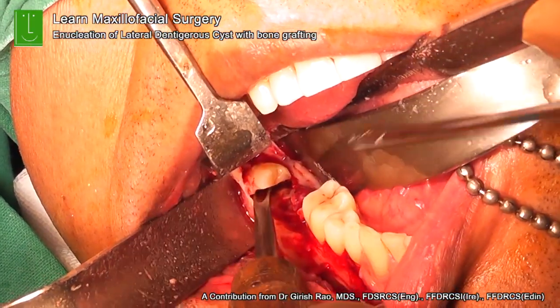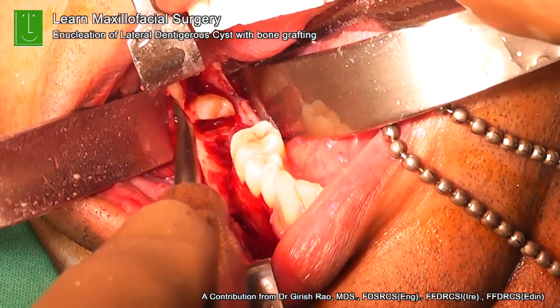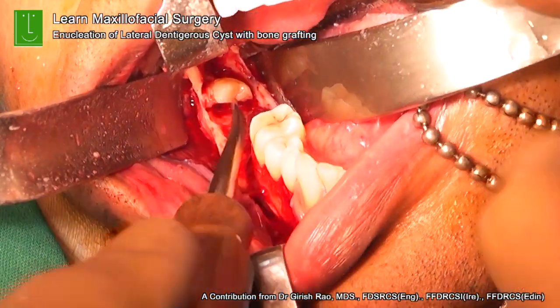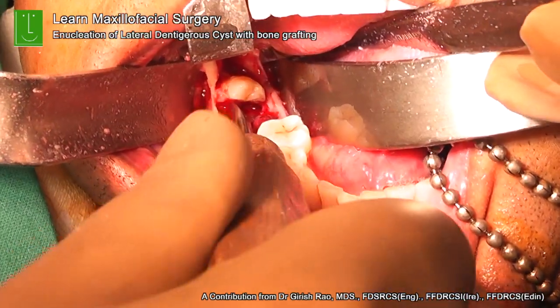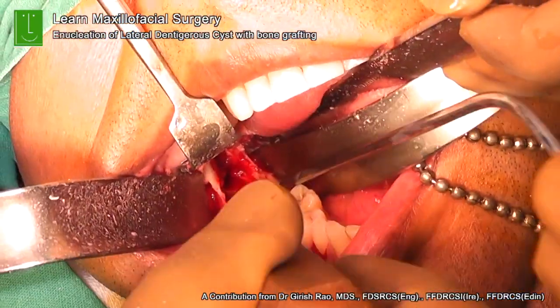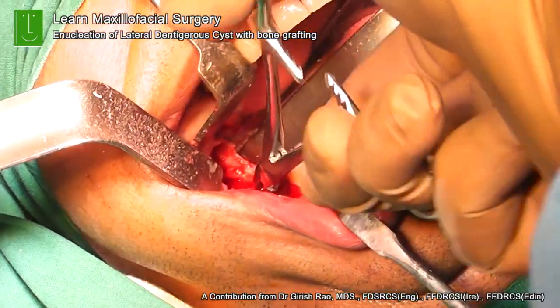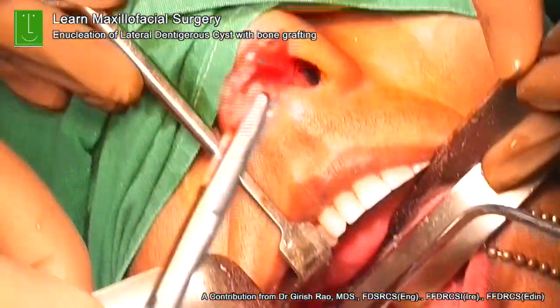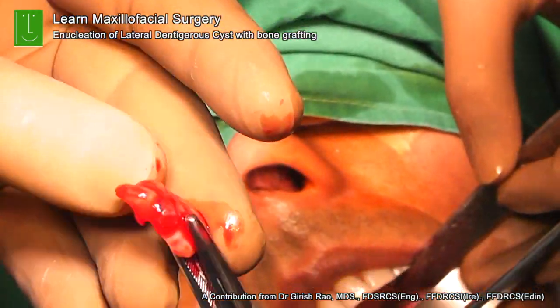Again, you need to be extremely careful that you don't use too much pressure. Very rarely you can even fracture and cause a pathological fracture of the jaw. So use minimalistic finger pressure, don't use your entire wrist. It's just a simple luxation which you need to do, and both the roots can be removed. Once it's split, it is so much easier. The entire tooth can be taken out in two fragments.